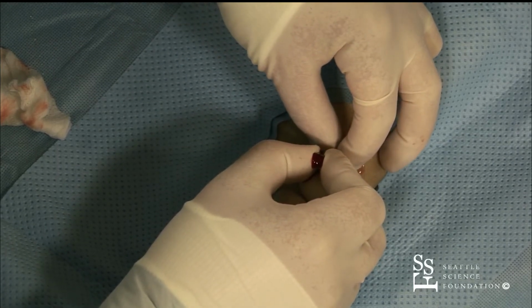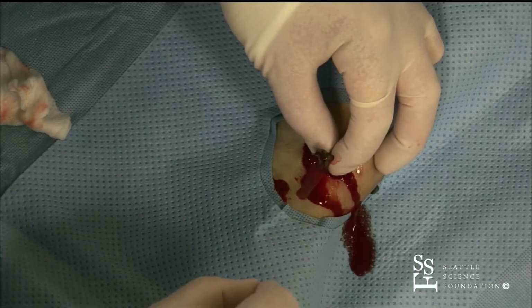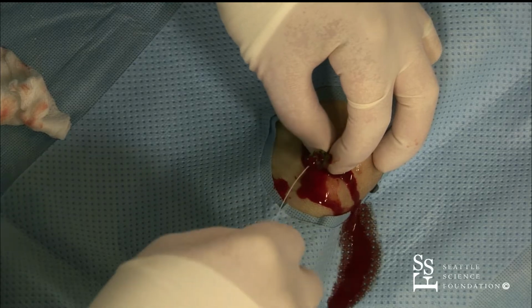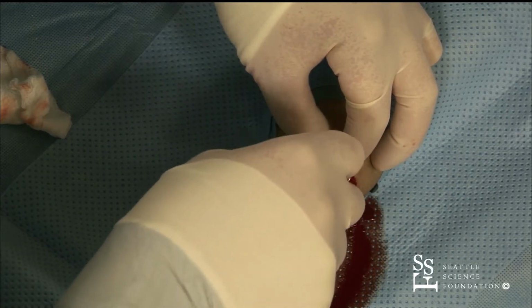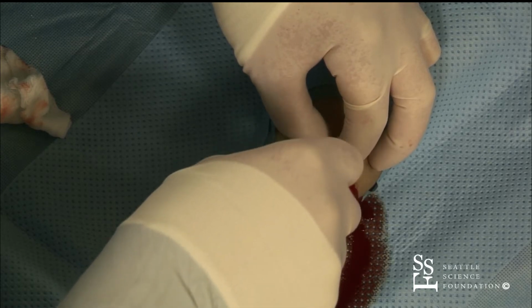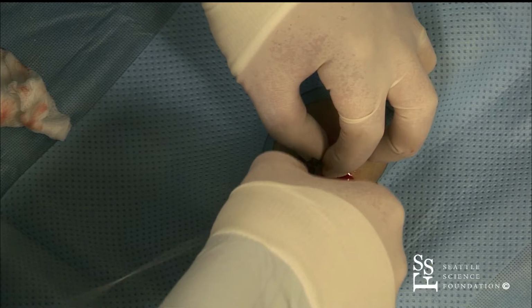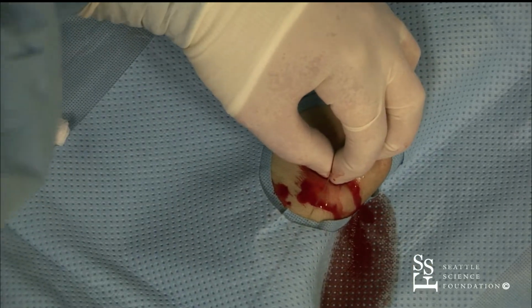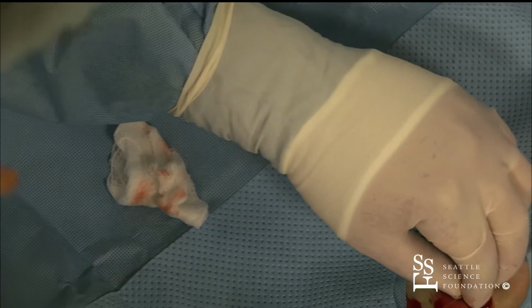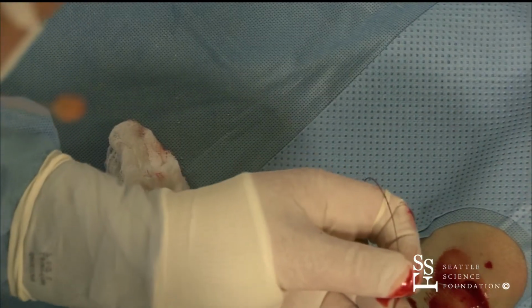So there you have the pulsatile flow in the needle, and now I think that John is going to introduce the wire. One important thing when you are getting access with the needle is that you don't use a hydrophilic or plastic jacketed wire to get access, because you can strip the coating off. When Jeff shows his technique with the angiocath, you can use the plastic jacketed wire. Right, Jeff? Yep.